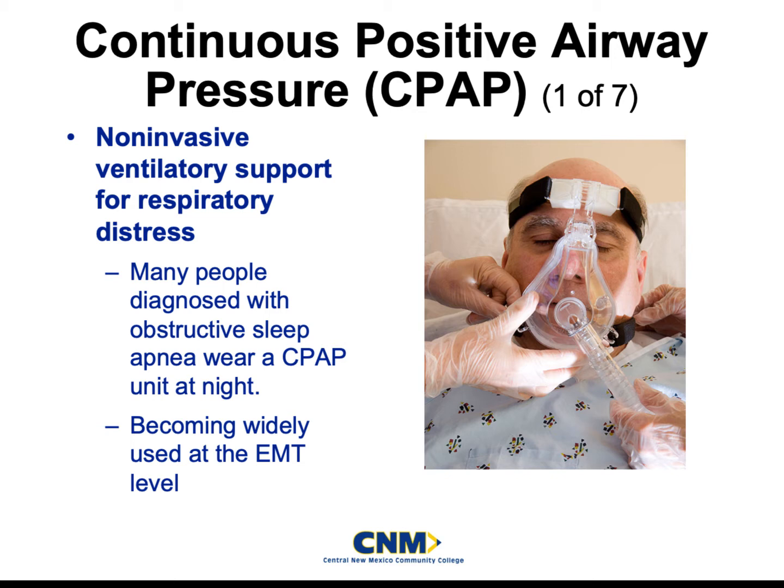And here we are trying to put this mask, and you can see the mask in this picture, right? It doesn't look very cumbersome, right? And we're going to put this mask over their airway when they're already short of breath, and especially if your patients are claustrophobic, right? Then we're going to really tighten this mask down with this head strap with a whole bunch of headgear to the patient, and then we are still going to have to coach our patient's breathing.